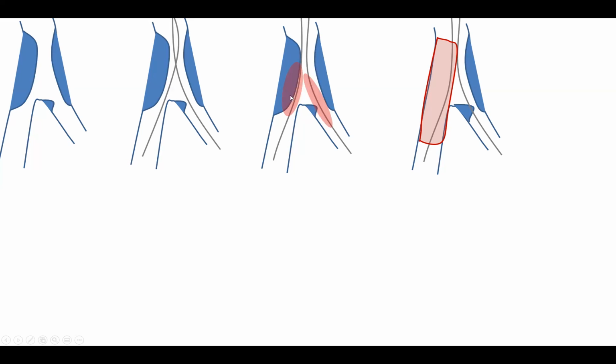So you double wire, then you balloon the main branch, and my preferred approach is to often dilate the side branch with a 1-to-1 sized balloon. Then you stent the main branch. The side branch should be dilated just before main branch stenting.